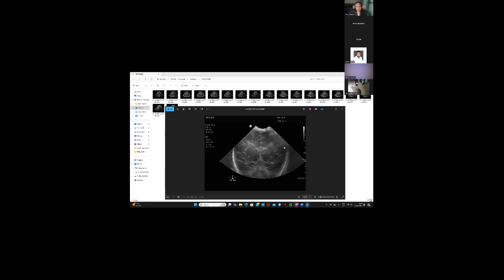Good image. My only comment about the images at the moment is that I'm a little worried about the gray white matter differentiation. Frontal blush was visible in the frontal lobe, but again it's a pretty dark image, and gray white matter differentiation is not as good. Neurologically, were you happy? The child is sedated and ventilated right now, so it's a little bit tricky.